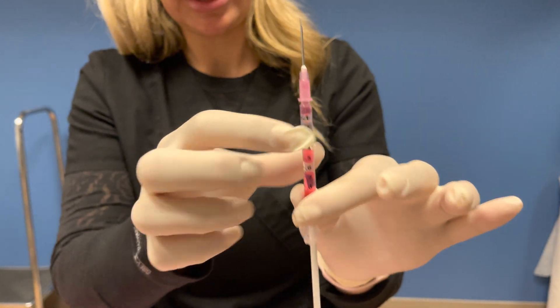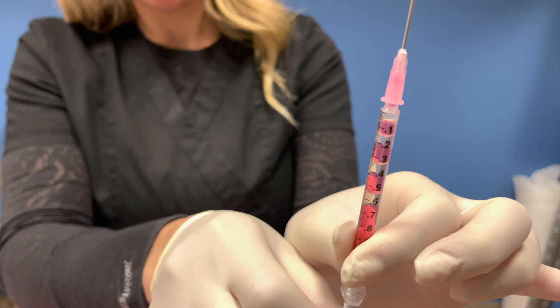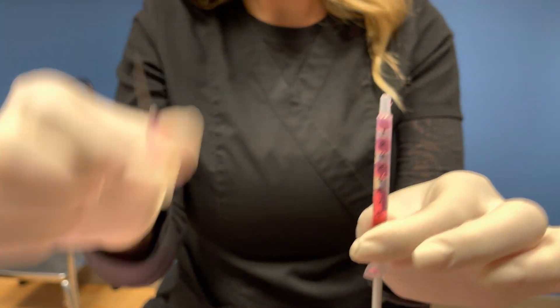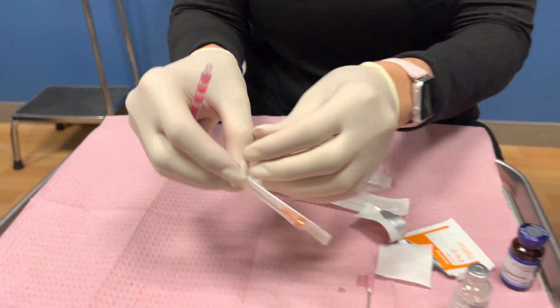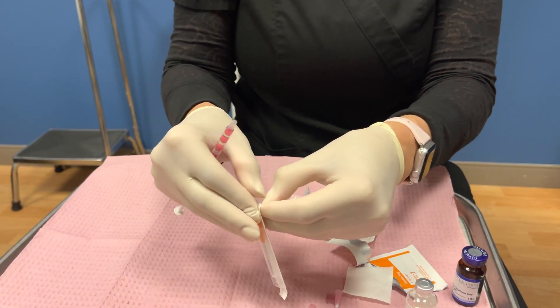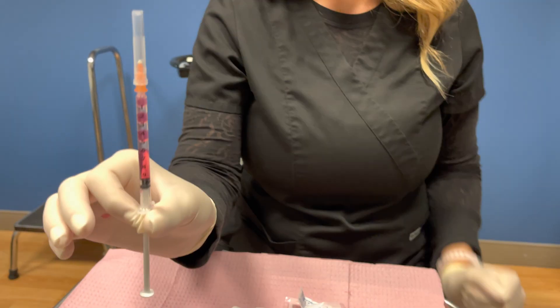If there is a little air bubble in there, you're just going to flick it until the air bubble goes to the top and then push it up. Now we're going to remove the 18 gauge and we're going to apply the appropriate needle to inject with. And there you go.